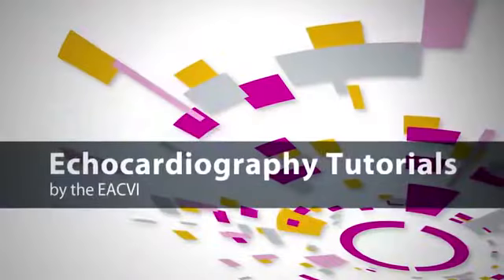So good luck. The key message is that we have first to exclude a primary mitral regurgitation, and secondly that we have to look not only at the valve but also at the left ventricle to assess the mechanism and the severity of mitral regurgitation, taking into account specific cutoffs for secondary mitral regurgitation.